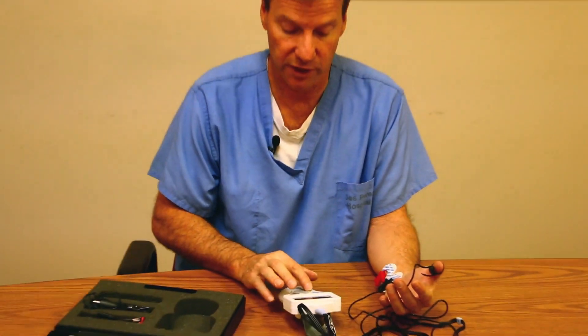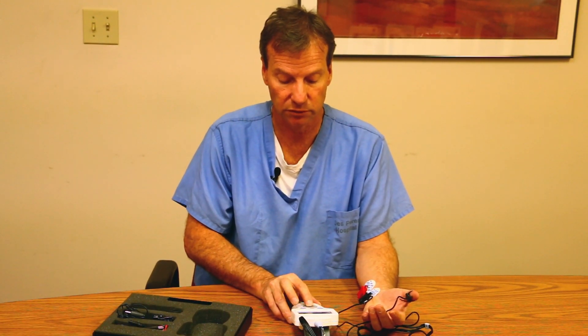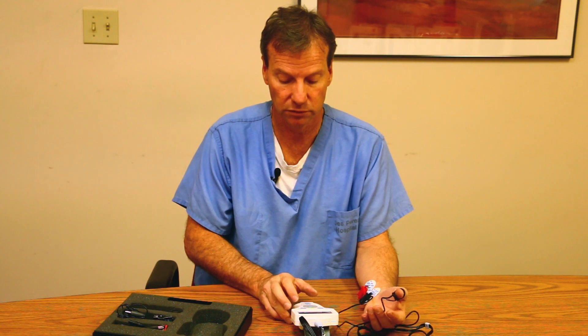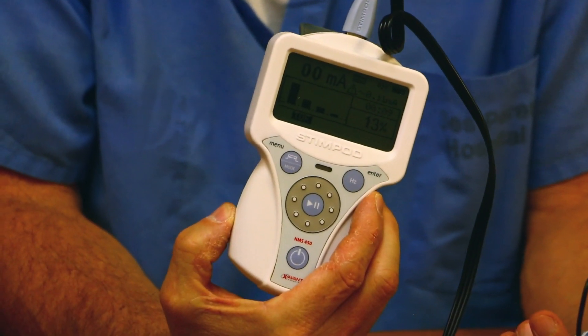If I did it again and turned up the stimulation a little bit to simulate — this shows 13%. So this would be a patient that is pretty paralyzed.